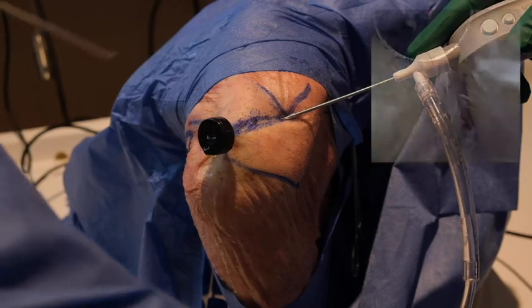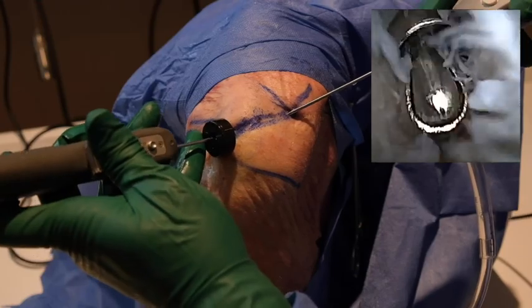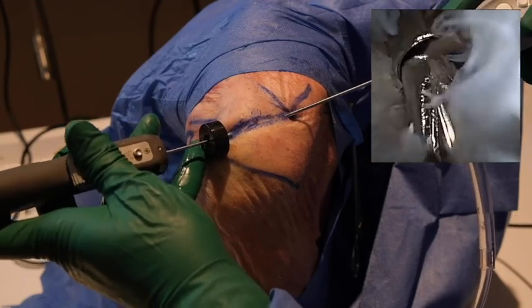With the anterior cannula in place, a 2 mm soft tissue shaver is inserted through the cannula. It is used for excising the articular disc when present and any soft tissue that is over the lateral end of the clavicle or obscuring vision.